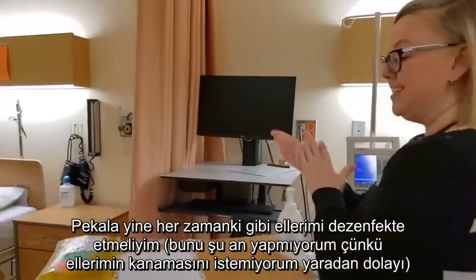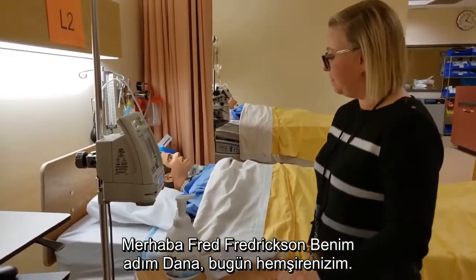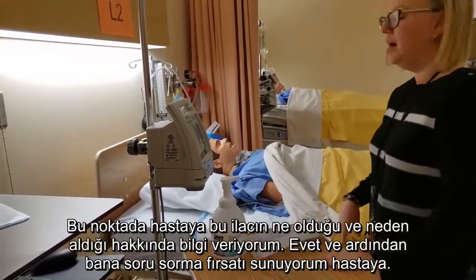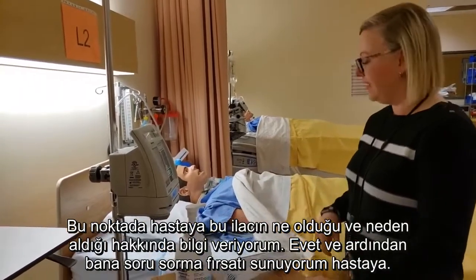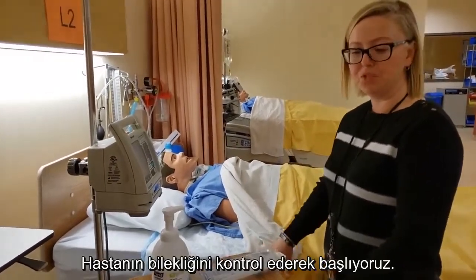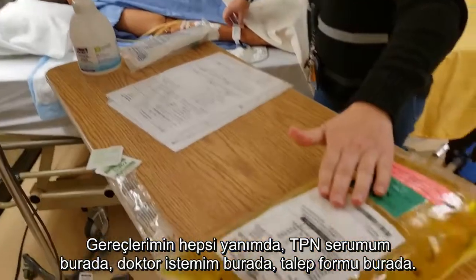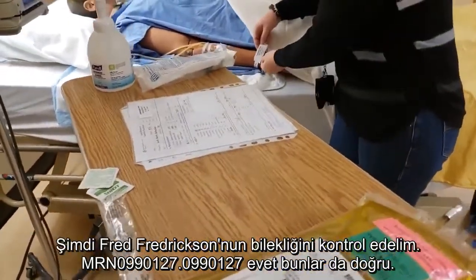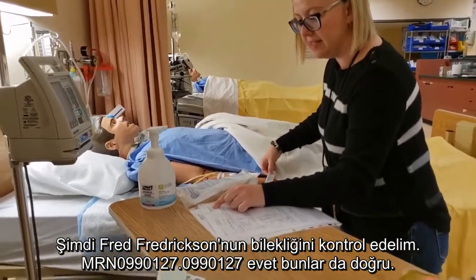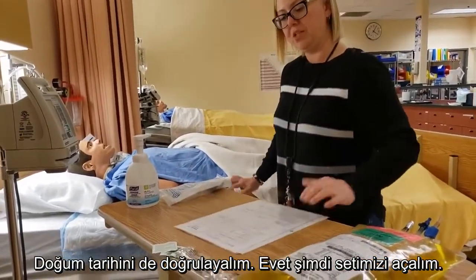At the bedside, I'm going to wash my hands. Hello Fred Fredrickson, I'm Dana, I'm your nurse today. I've got an order from the doctor for TPN — total parenteral nutrition — that will go through your central line. I would give some education on what that is and why he's getting it, then offer him the opportunity to ask questions. I know he doesn't have any allergies, so we check our wristband: Fred Fredrickson MRN 099-0127. I would also get him to state his birth date for my second patient identifier.